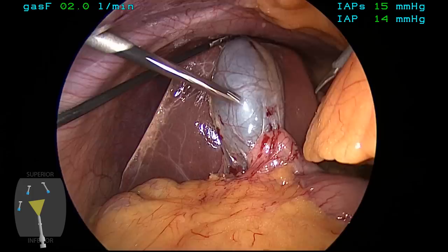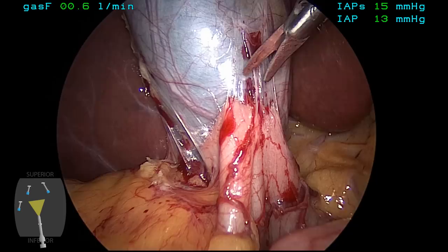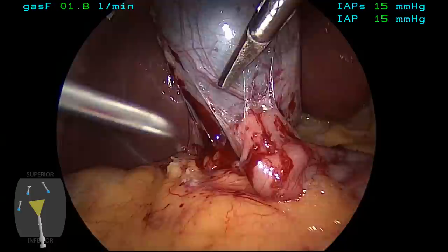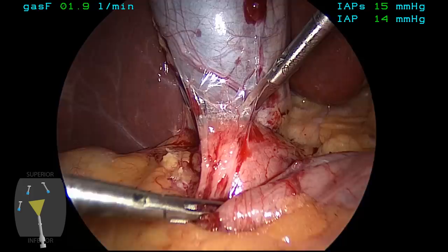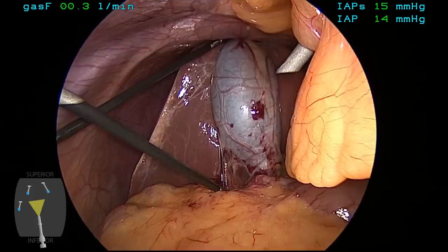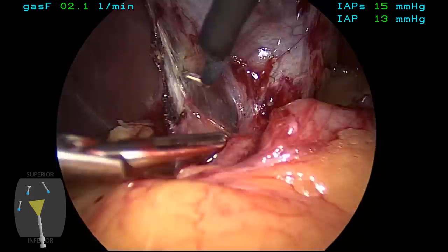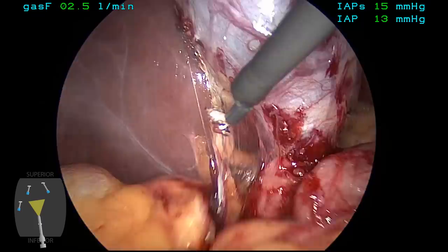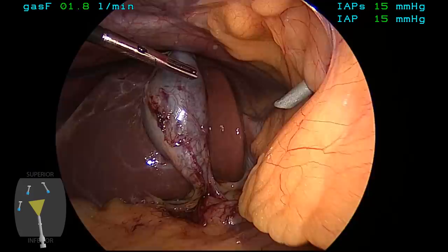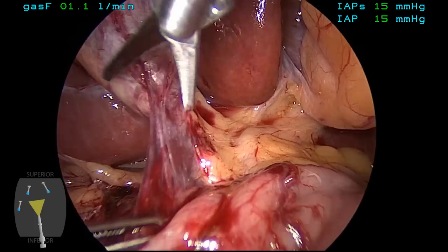One can also see in this case that the duodenum is adherent to the gallbladder. And because of risk of thermal injury to the duodenum, we're going to divide these attachments sharply with the scissors. Gentle traction is placed on the duodenum because we don't want to have a duodenal serosal tear from the traction. And then these remaining adhesions are divided until the neck of the gallbladder is free. These are relatively avascular, so we can do this with sharp dissection. The remaining lateral attachments away from the duodenum are again divided with the monopolar L-hook device, and then there are just a few remaining duodenal adhesions that we're going to divide sharply.